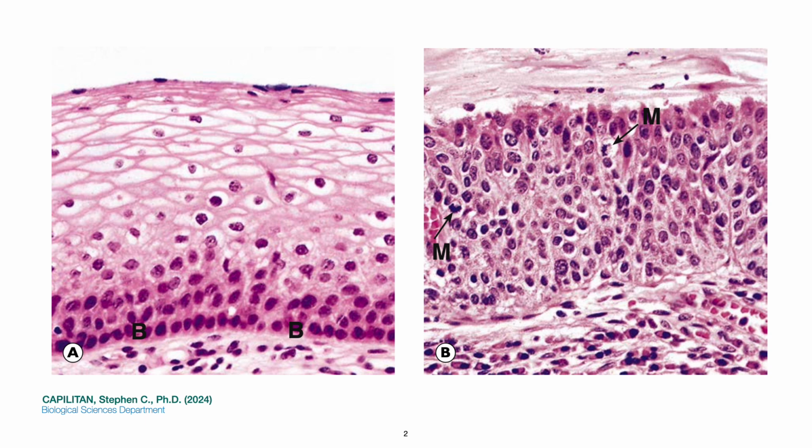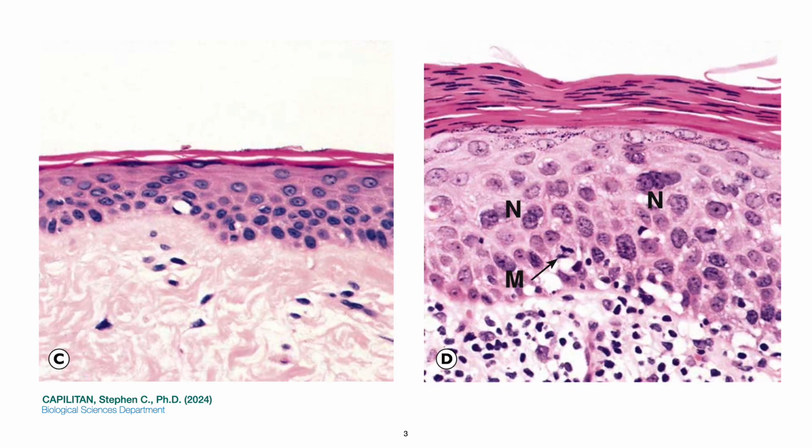The nuclei of the cells are more variable in shape and size than normal, and they exhibit pleomorphism. And the nuclear to cytoplasmic ratio is greater than normal. It is the presence of such surface cells with large nuclei that alerts the cytologist to underlying dysplasia in a cervical smear.